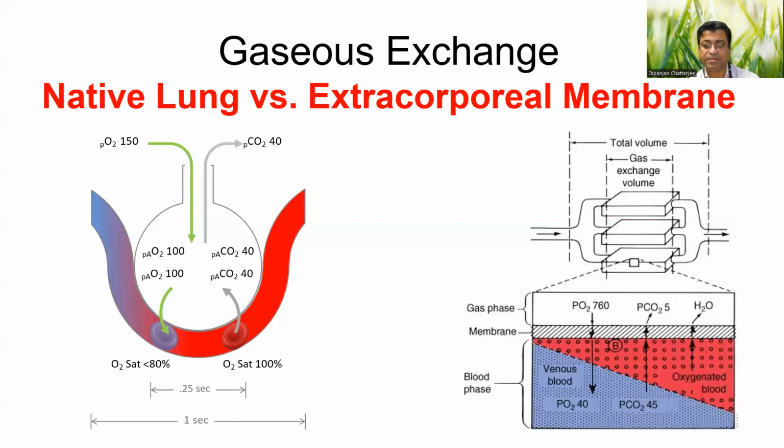The membranes are set up in such a way that this barrier layer of RBCs constantly changes and more RBCs come in contact with the membrane. It is not a linear flow that is targeted within the membrane lung.